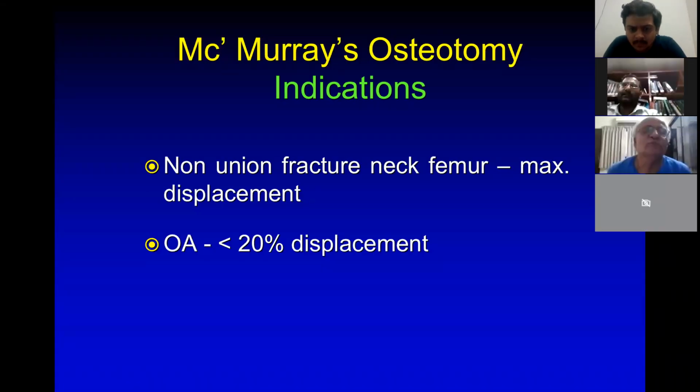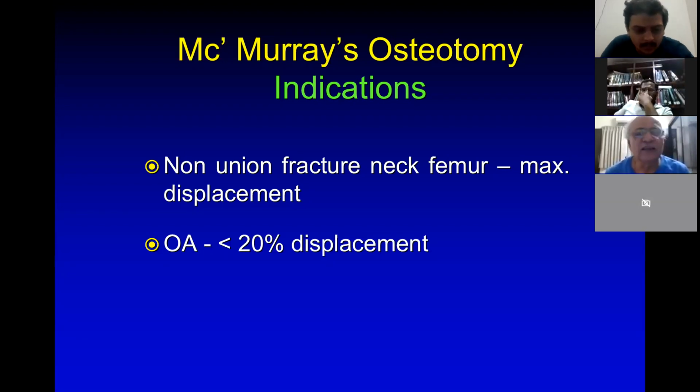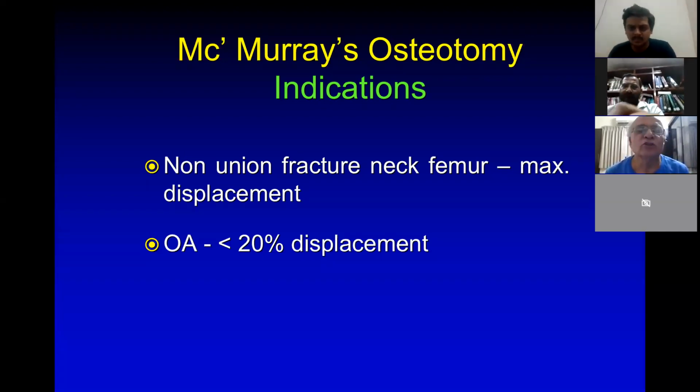Again, from our own block. So we have finished on the acetabular side, a couple of osteotomies. Today we will try and complete the osteotomies on the femoral side. So this is the first osteotomy which I described, I told you, the McMurray osteotomy.